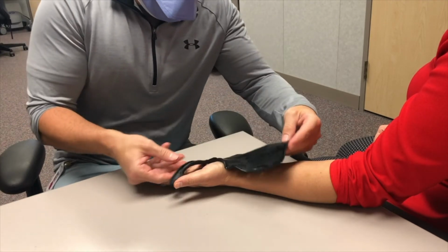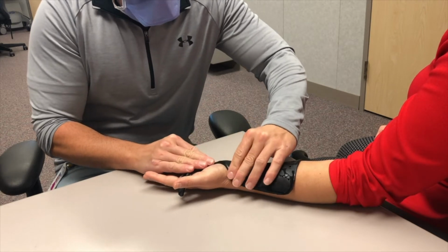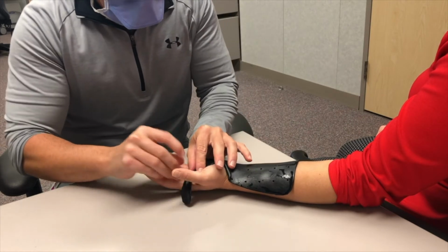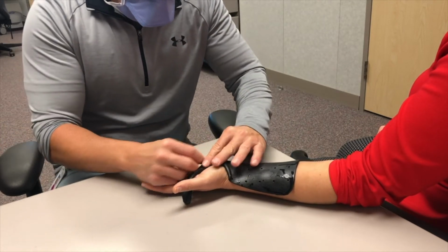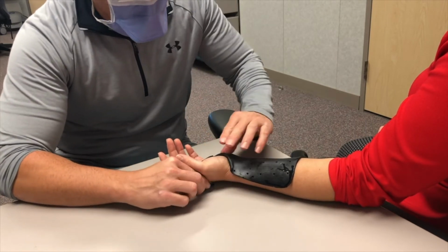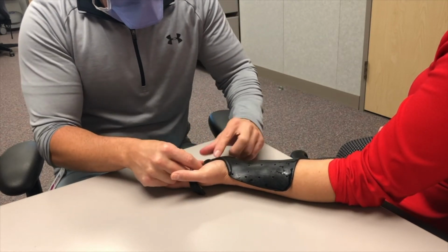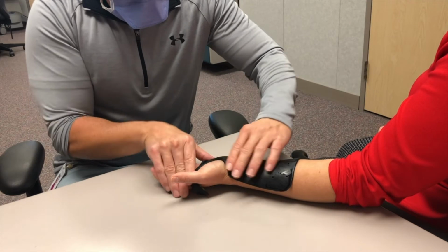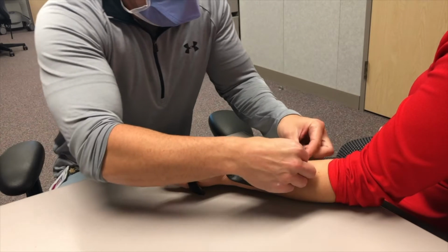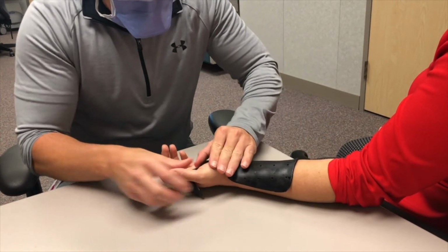After you get your heated material, you want to lie it down on your client, and you want to begin with rolling out the thenar eminence and then rolling out your distal palmar crease. You always want to do your rolling when the splint is at its warmest. Rolling will increase cosmesis, but more importantly, it improves the strength of the material as well as it provides some contour. We need to flare the proximal edge just slightly.